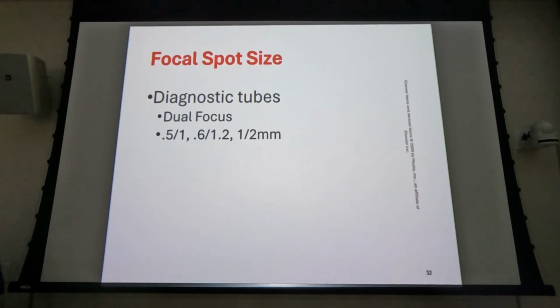There are tubes where we need higher inherent sharpness, recorded detail, and that's what this controls: sharpness, recorded detail. I'm going to try something. I don't know if this is going to work. That's too bright. Okay, so let's do this. Bring the lights back up.